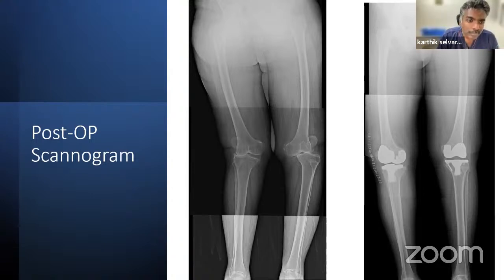So you have got the X-ray. In the X-ray room, you can measure the angle between the mechanical axis and the anatomical axis of the femur. And then keep that angle. There is software. You can go to the X-ray room. Anybody can do it. It's easy.